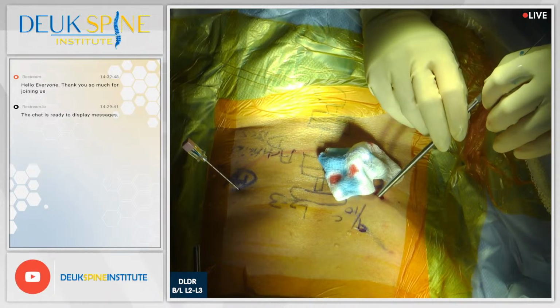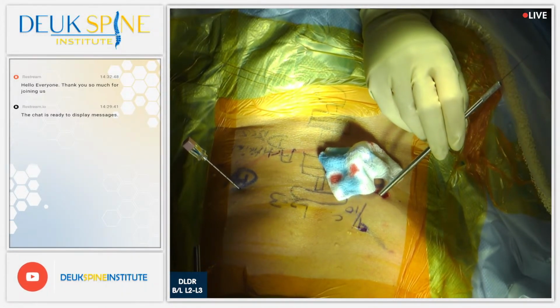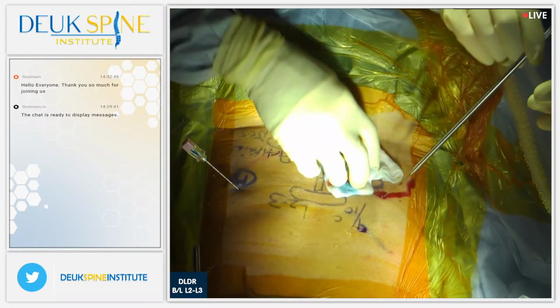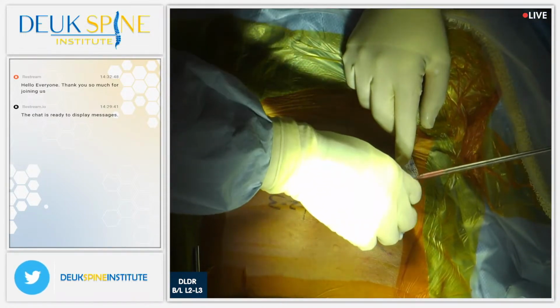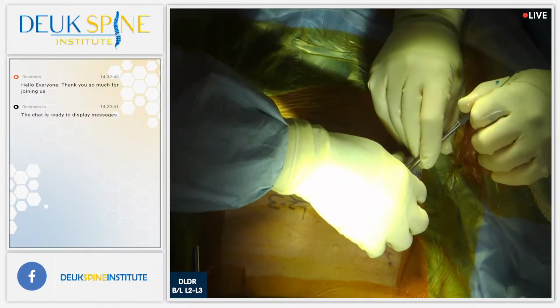And so what happens then is that, let me just double check this. That's in the center, right? Yeah, it is. All right, good. Just the other side looks odd.